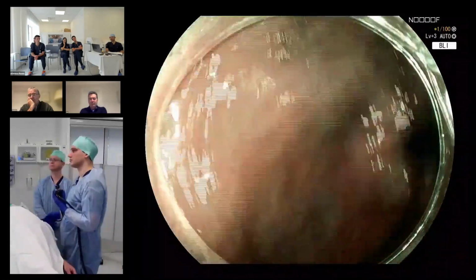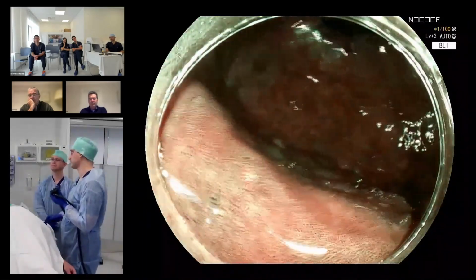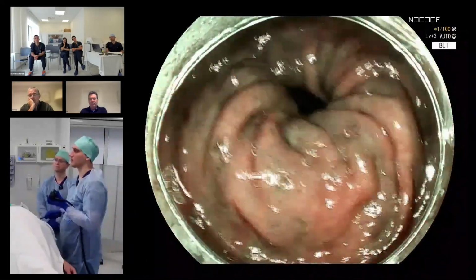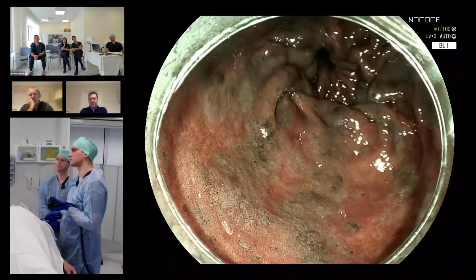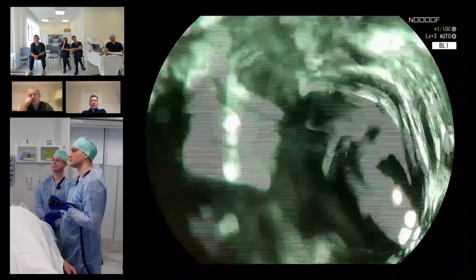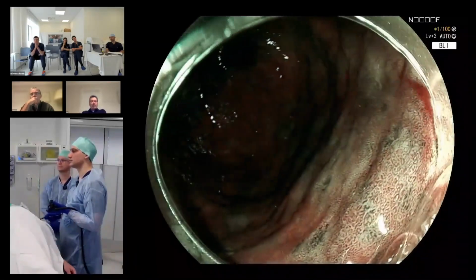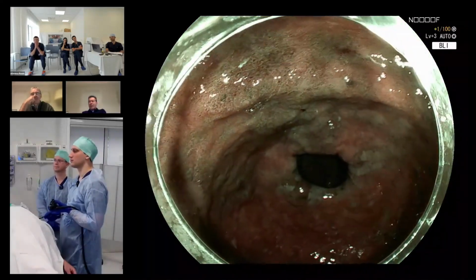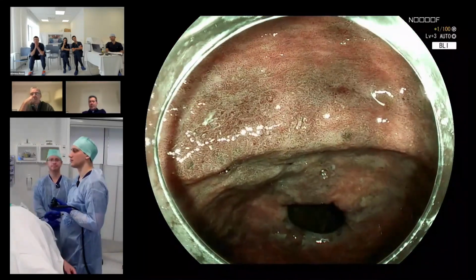Try to avoid traumatizing the mucosa, Michele, if you can. So the question is how we deal with this complexity, because it is a lot. And how we have a structured, more deconstructed approach to this problem, because it is not unsolvable, but it is definitely difficult.